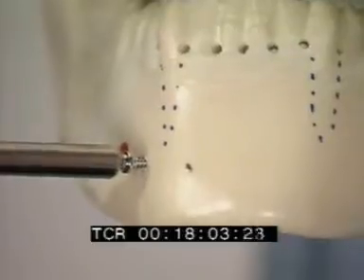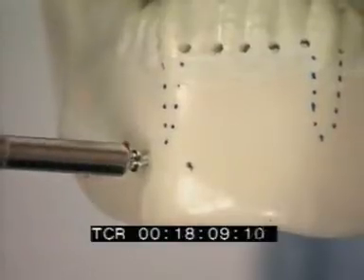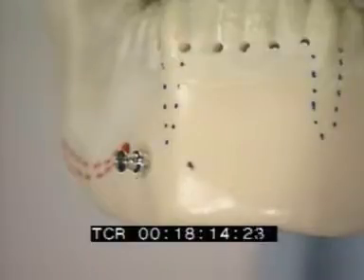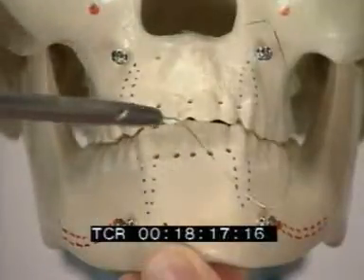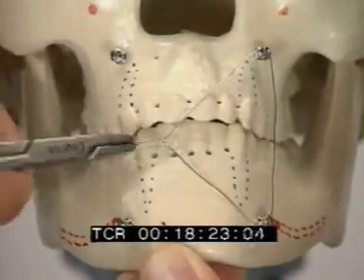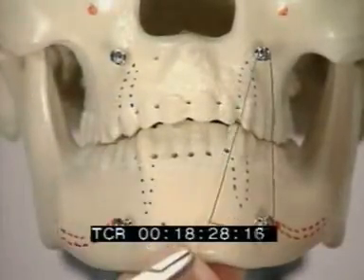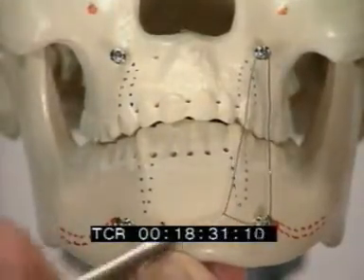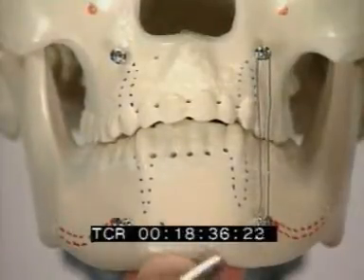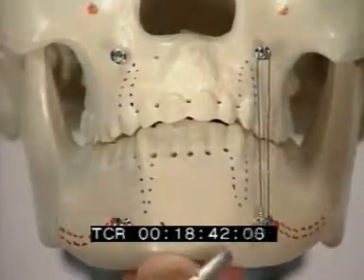Care has to be taken that the screw head does not compress the gingiva when fully seated. 2 more IMF screws are inserted on the opposite side. Mandibulomaxillary fixation is performed with 0.4 millimeter wires. The wire ligature is wrapped around the screw head grooves. Before tightening the wires, correct occlusion has to be established. The wire is tightened either at the superior or inferior screw head to prevent soft tissue damage.